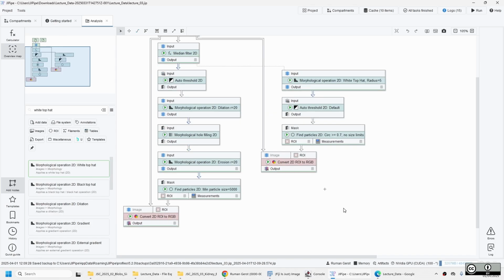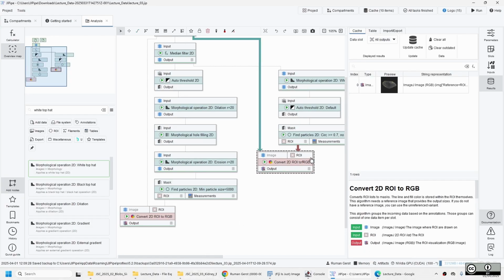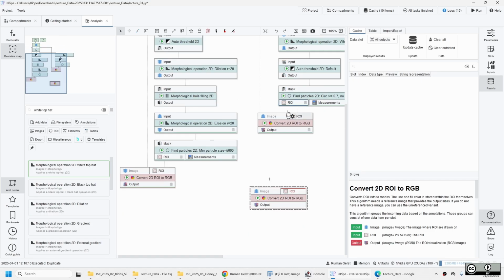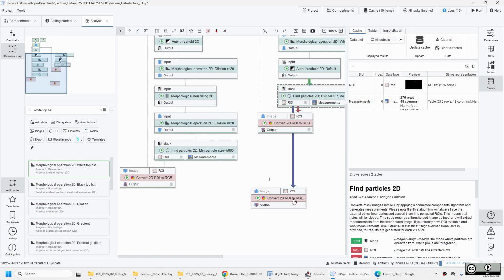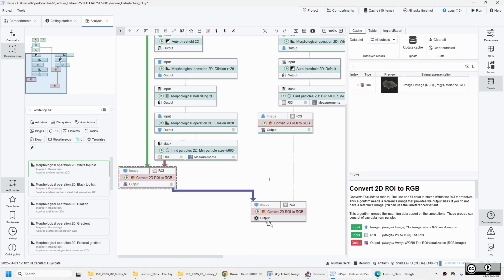And then we can also do something nice. Maybe we want the glomeruli and the tissue both in one visualization as well. So I am duplicating this one here. This one I want to keep, but I also want another visualization, so you can also duplicate that one. And then I am drawing my glomeruli not on the original image, but on the one that the tissue made, because it just yields an image as output. So we can stack things on top of each other very easily.